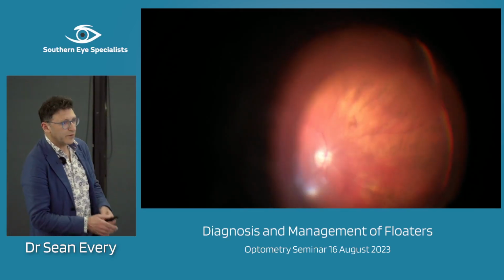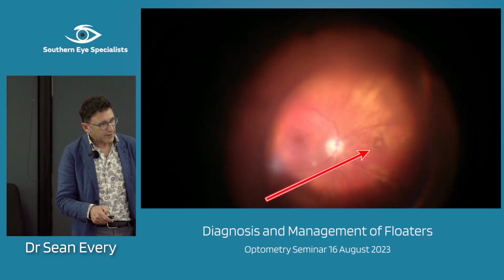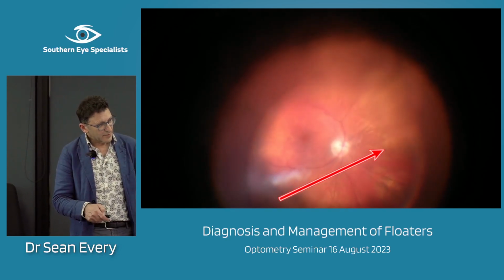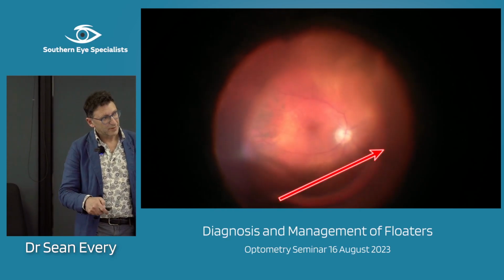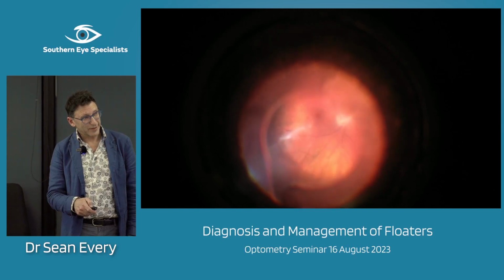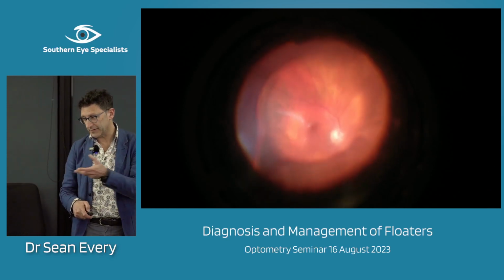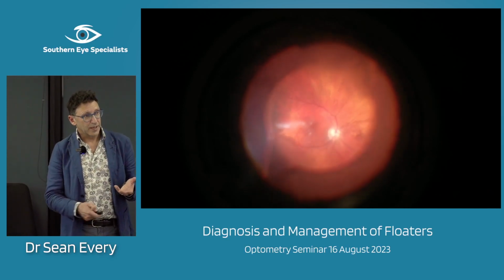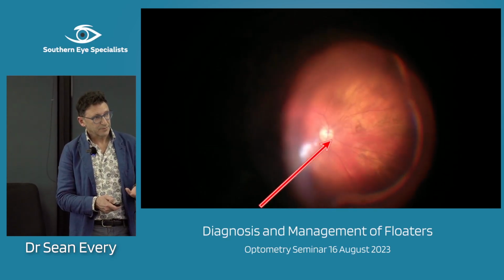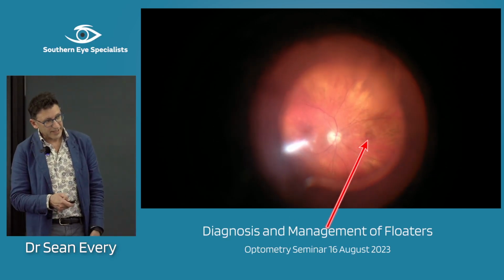And the thing I like about this movie is that see, that is a shadow. That's the shadow of the Weiss ring. That is the Weiss ring there. See, that's the shadow, and then this is all the nebulous material. See all those clouds, so it's got all three. But that is the shadow. It's crazy, isn't it? You think, oh, there's the Weiss ring, but actually that's the shadow that's been cast. Obviously I've got a light pipe inside the eye, so I can create some pretty intense shadows. There it is, the shadow there, and the Weiss ring is just drifting around in this location here. There you can see the Weiss ring, and the shadow there, and then all this nebulous stuff there.